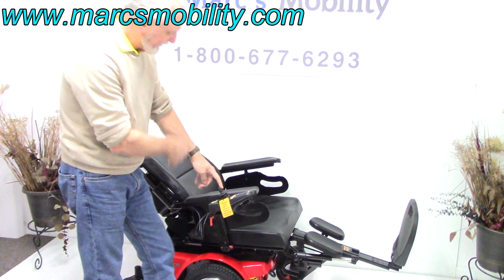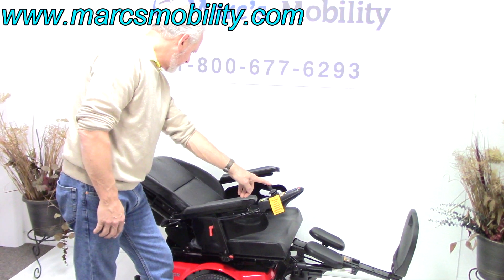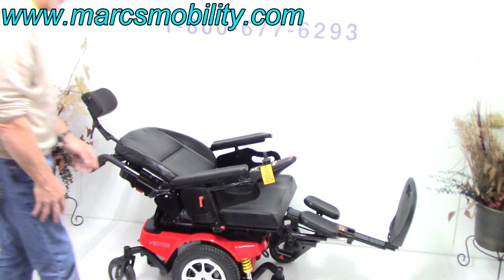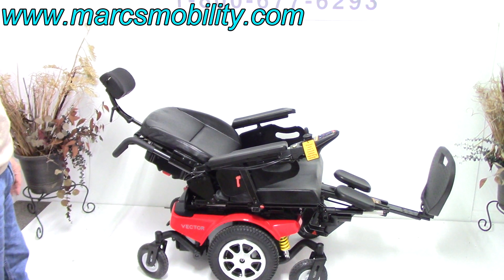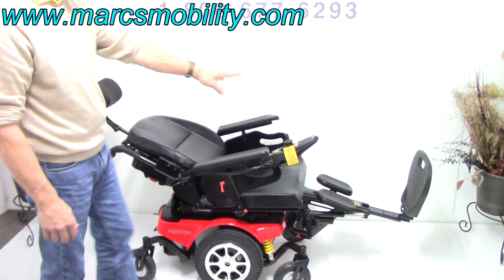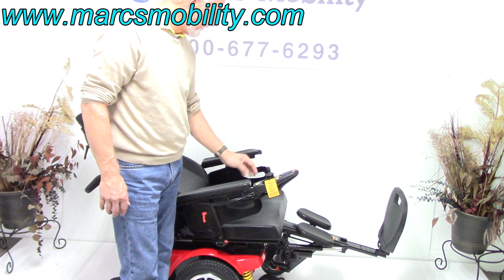The joystick can go on the left side if you're left-handed with no problem at all. So if you want to know what it looks like when you're all the way down flat reclined — that's what it would look like. That's the recline position for this chair, as far down as it'll go.